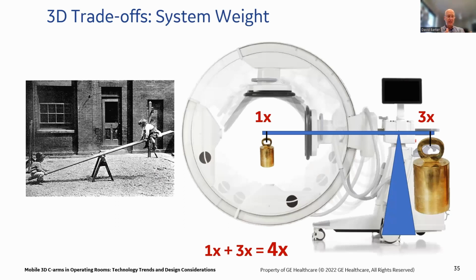So it's a lot like a teeter-totter problem with 2 little kids. You have one kid who is using the fulcrum to their advantage, and they can keep this other person suspended in the air, even if this other person weighs a lot more than they do, just because of the mechanical advantage. We have the reverse problem for a C design.